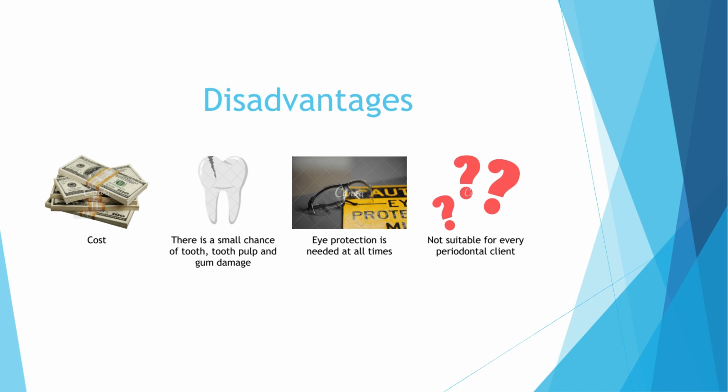Finally, lasers may not be suitable for some individuals, or some forms of periodontal disease may not respond well to laser therapy. And in certain situations, conventional techniques may be more effective for some clients. But in conclusion, with doing this research, it is proving that the advantages definitely outweigh the disadvantages, and this is a great option.